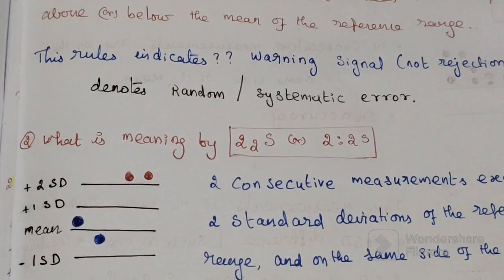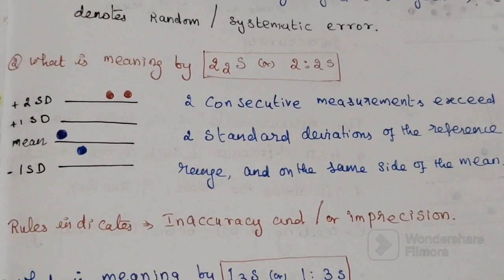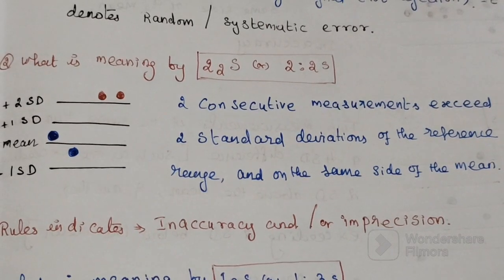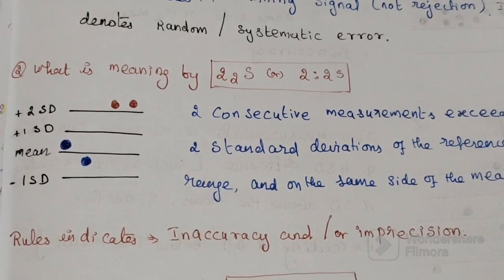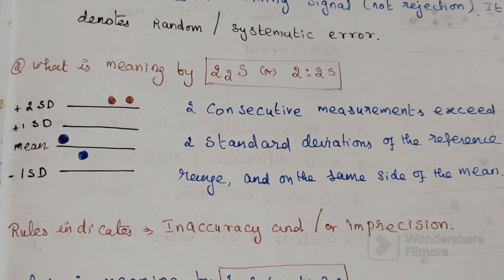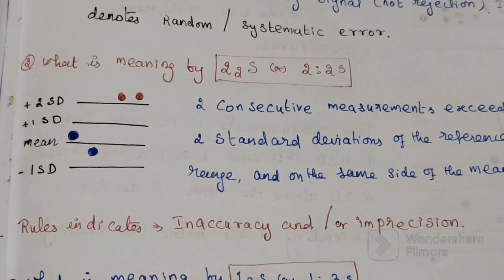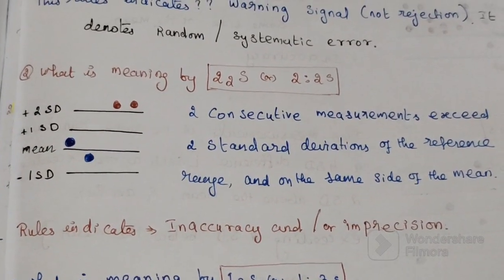But let's say you are running both normal control and abnormal control. In the abnormal control you get one control measurement above 2 standard deviation, and in the normal control also, then this is also called the 2 2s rule, within run. Both normal and abnormal control material gave a value above 2 standard deviation. That's why it is called the 2 2s rule. It denotes a systematic error.